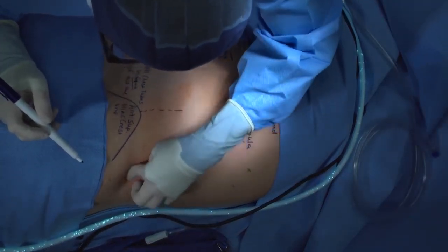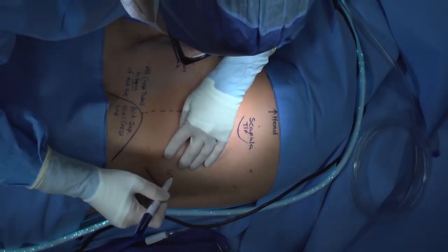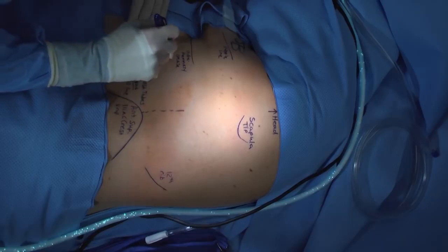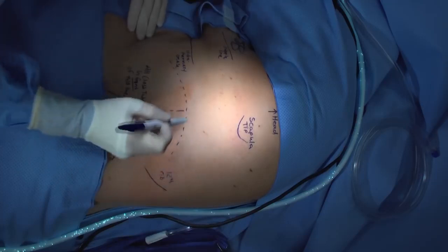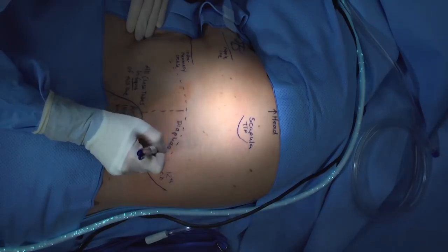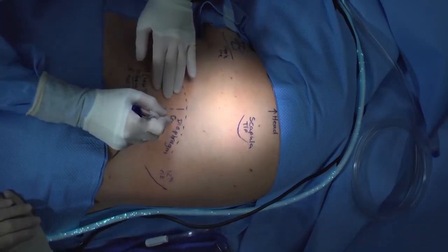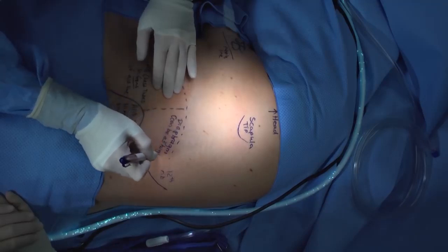Next, identify the 12th rib. This is going to help you approximate the lie of the diaphragm. Remember that the dome of the diaphragm can be as high as T4 or even more elevated in certain disease processes. These can include diaphragmatic paralysis, diaphragmatic eventration. It is essential to know your patient's history and to review your radiology very carefully before beginning your procedure. Sometimes having the chest x-ray on the screen in the room is also very helpful.